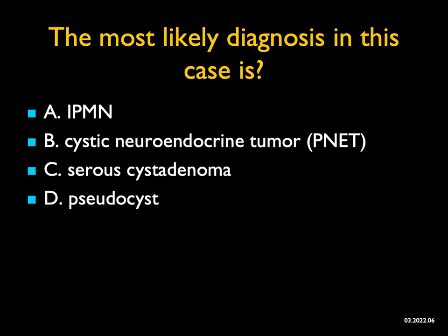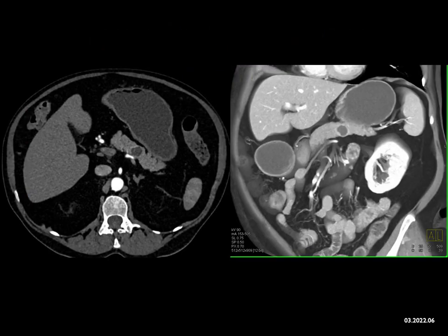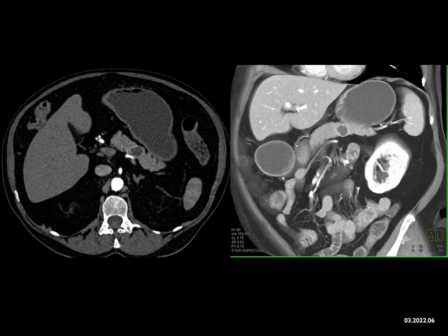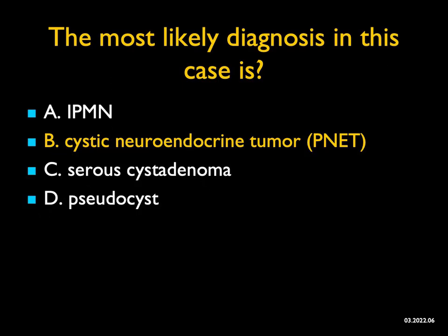The most likely diagnosis in this case — I see a cystic mass in the body of the pancreas. Quickly I'm about to say IPMN, or maybe because of location I could consider mucinous cystic neoplasm. A serous cyst adenoma would be small and not a great location. It could be a pseudocyst if the patient had pancreatitis. But then I look at this lesion more carefully — particularly appreciated on the coronal views but also on the axial — the lesion has rim enhancement. When I see a cystic lesion in the pancreas with rim enhancement, I'm thinking about a cystic neuroendocrine tumor. Classically, they may not obstruct the pancreatic duct, may be well defined, and can be misdiagnosed if you have non-contrast or late venous phase imaging. Cystic neuroendocrine tumors' rim enhancement is best seen on arterial phase imaging. A really good case and a real potential pitfall.